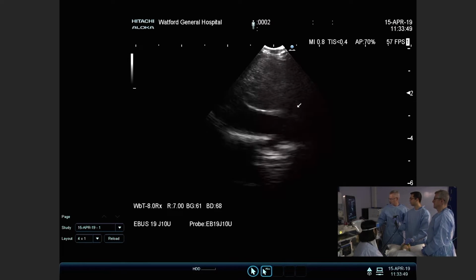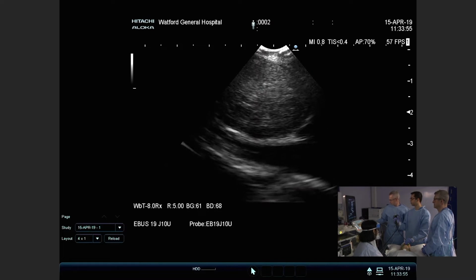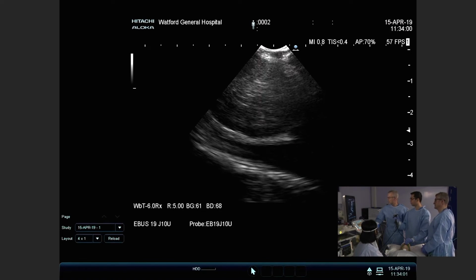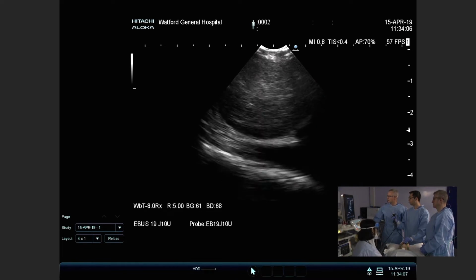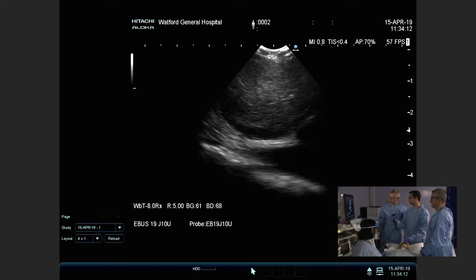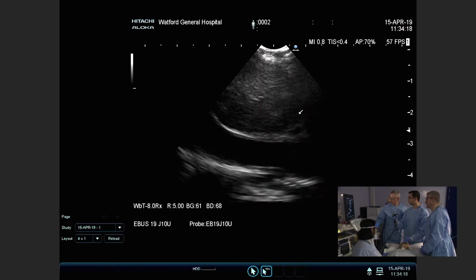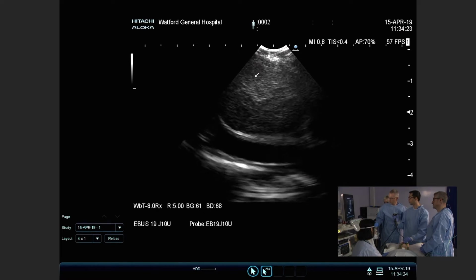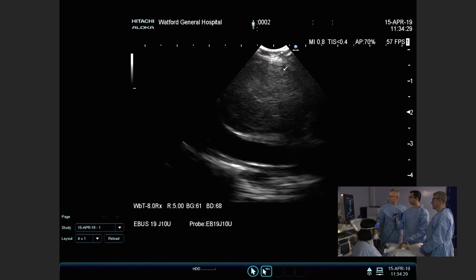If I can just indulge you for a second, so we can hone in on that. So very clear distinct margins and round shape. So 4 features: round shape, distinct margins, heterogeneous echogenicity, and central necrosis or loss of central hilum, either or. Now, do we have any clear areas of central necrosis here? Maybe. I think you have got some darker islands in there, and up here as well. Areas of central necrosis there, I think.